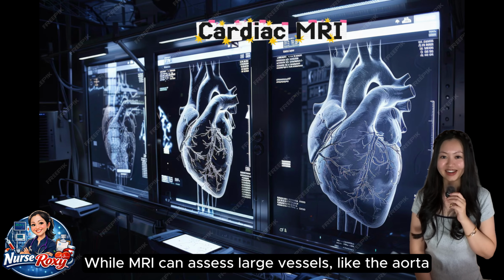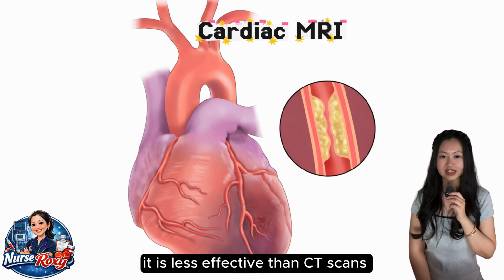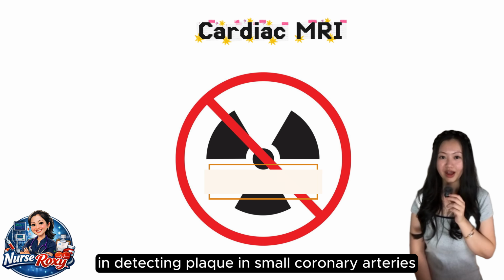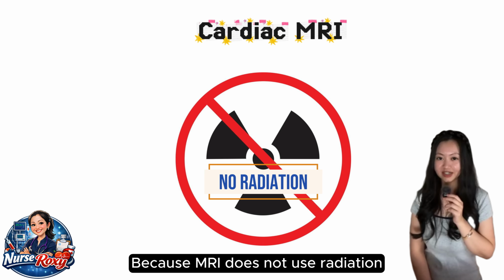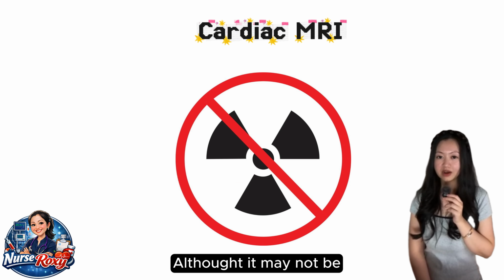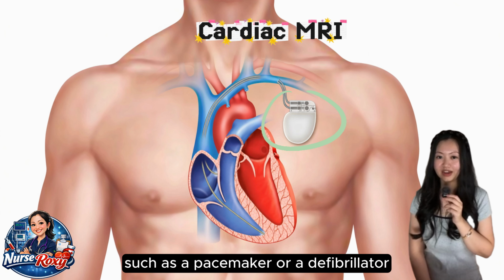While MRI can assess large vessels like the aorta, it is less effective than CT scans in detecting plaque in small coronary arteries. Because MRI does not use radiation, it is generally considered safer, although it may not be suitable for individuals with certain metal implants, such as a pacemaker or a defibrillator.